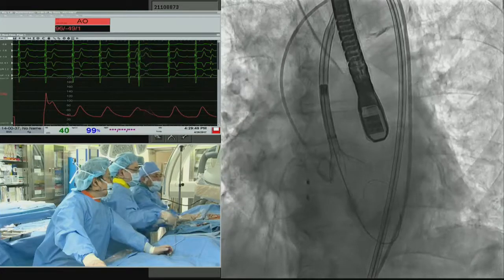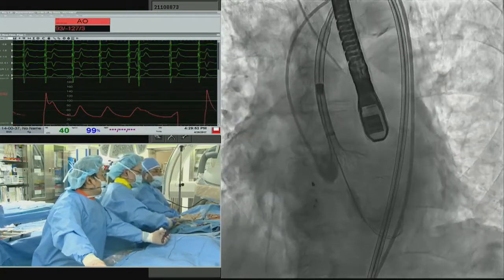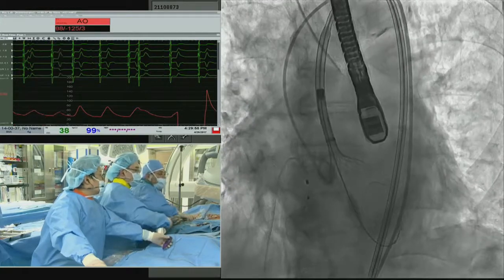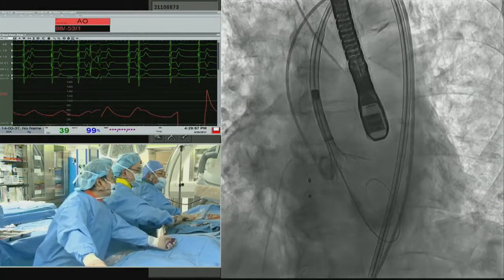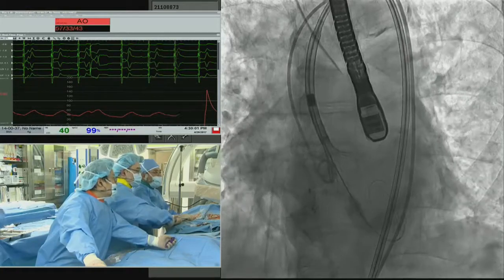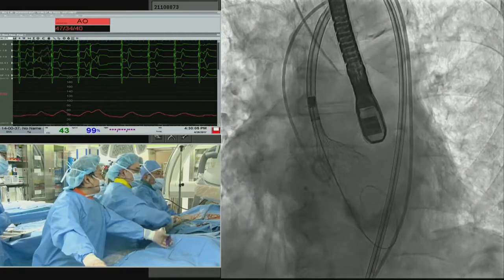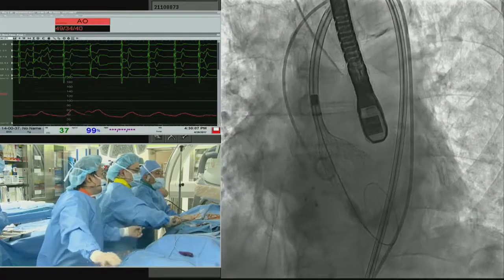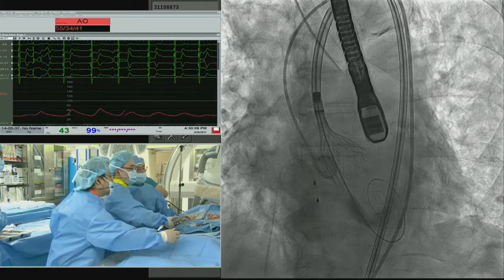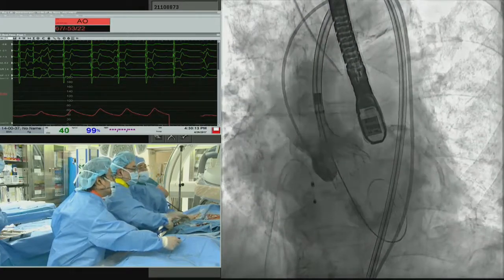Go ahead. The risk of starting this high is a pop-up, of course. You should push hard at that time. Sometimes you can start being more coaxial by putting the valve on the greater curvature and then applying pressure on the wire just to stabilize the valve. Okay. That required quite sensitive cooperation between the two operators.